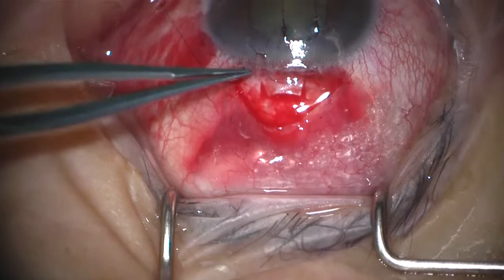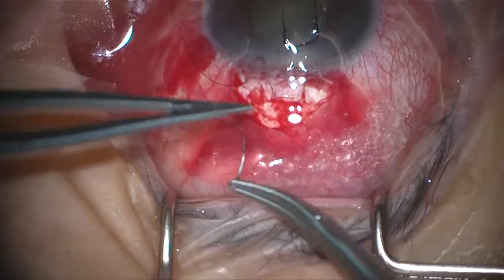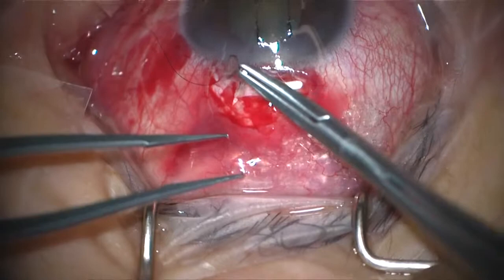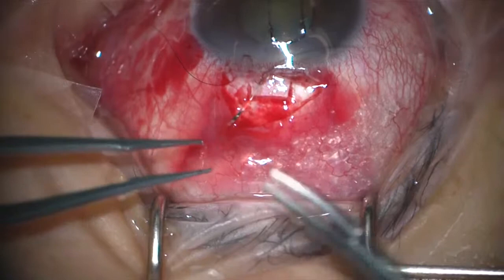So when I pull that, the loop gets buried in the corneal groove, so we can remove it easily if we need to. So I'm going to try and make this partial thickness in the groove, and then we'll pull that through and then leave a short loop so we can tie the releasable.